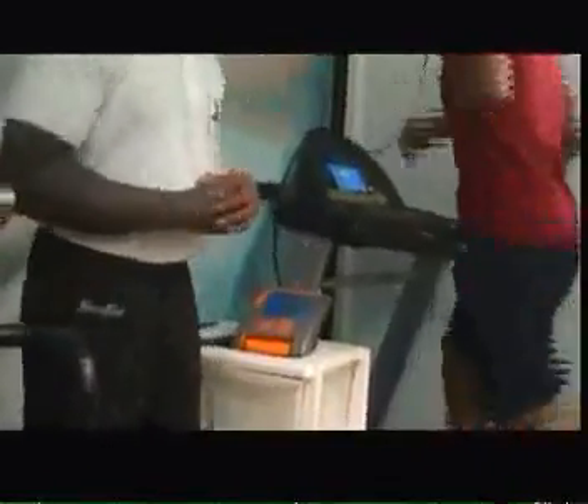At the end of this test, we'll get a figure which gives us a VO2, which is measured in liters, divided by body weight, and that will give us an indication of his aerobic fitness.